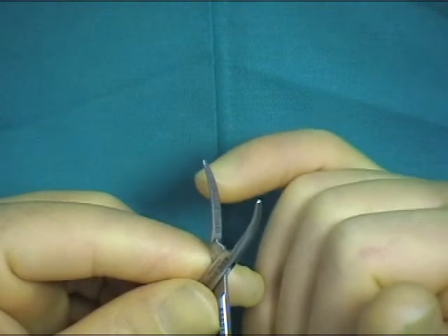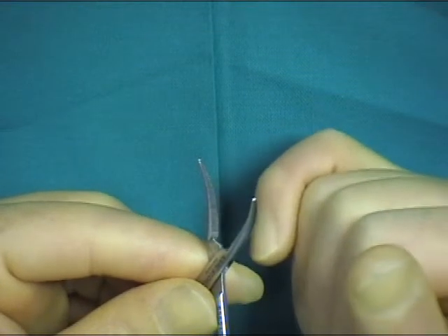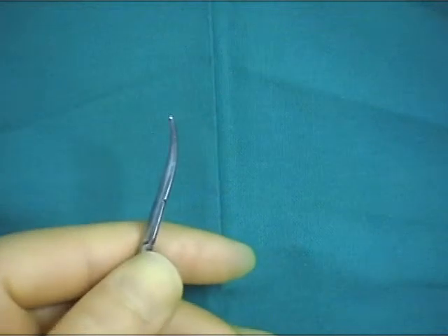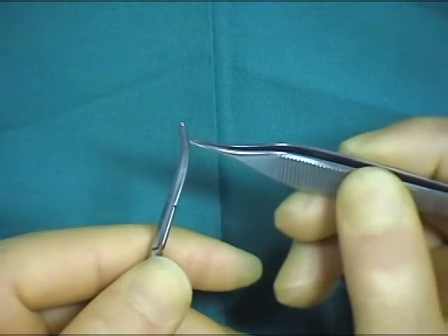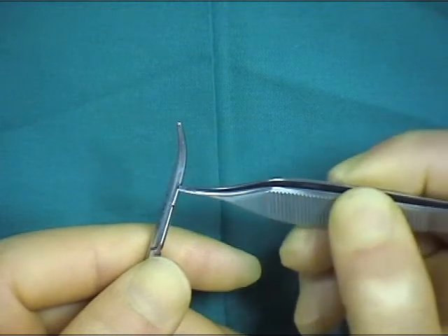When using these instruments you should not grasp tissue at the very tip of the hemostat but rather slightly proximal to the tip. This allows suture material to be readily passed around the tip of the hemostat for subsequent ligation of the structure.